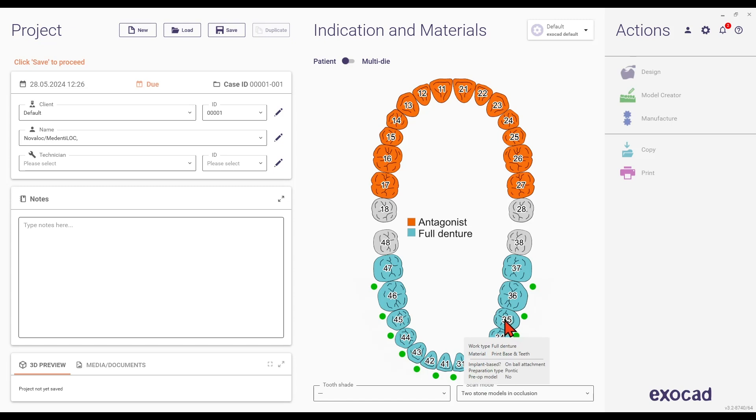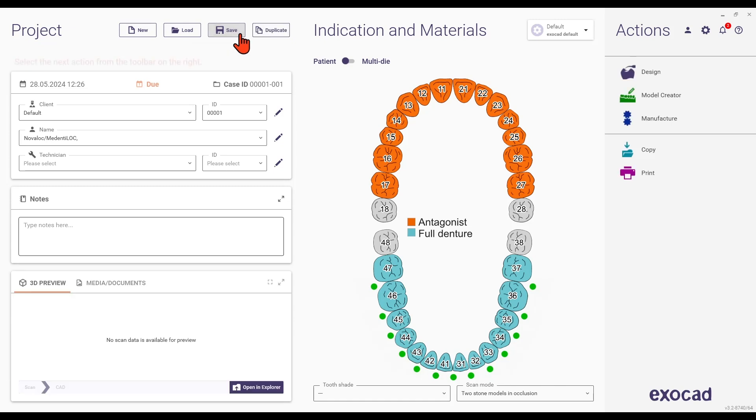After setting up all tooth positions, click save and then design to proceed with importing scan files.